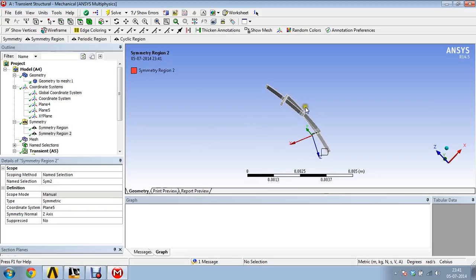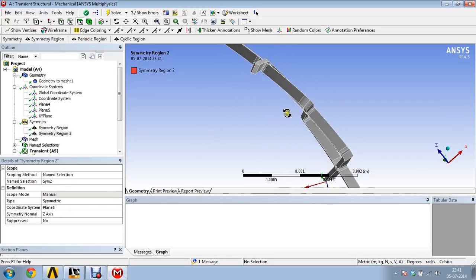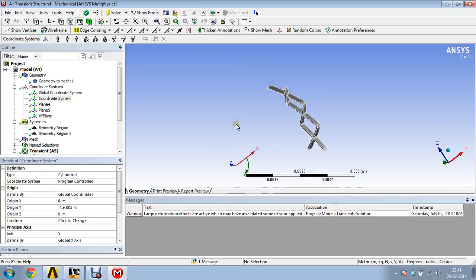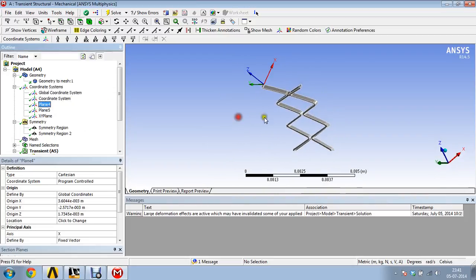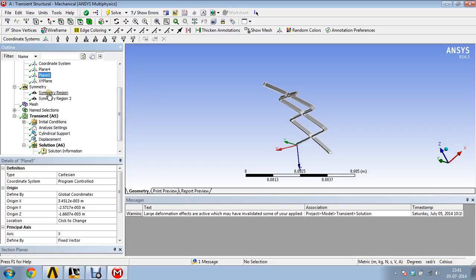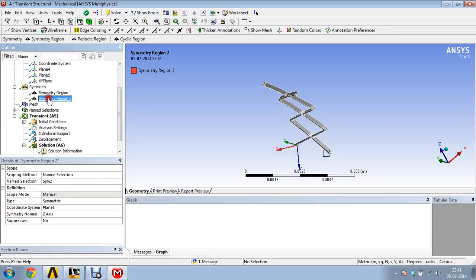The major point here is to understand why these symmetric planes have been defined. This is defined because the model is symmetric around the circumference. If you go around the circumference in this coordinate system, the model is symmetric. Beyond this plane and beyond this plane, the model is the same. That's why we have given the symmetric boundary conditions on it, symmetric region 1 and symmetric region 2.